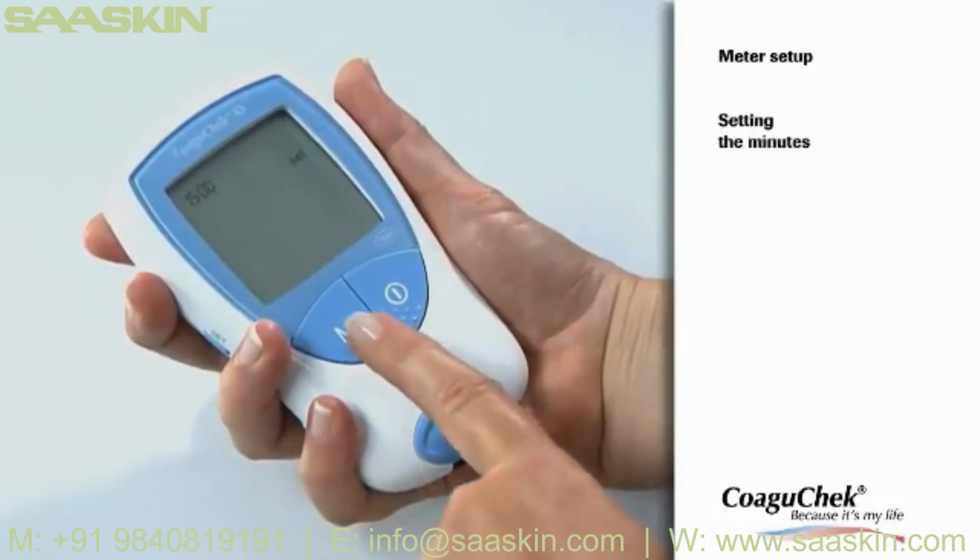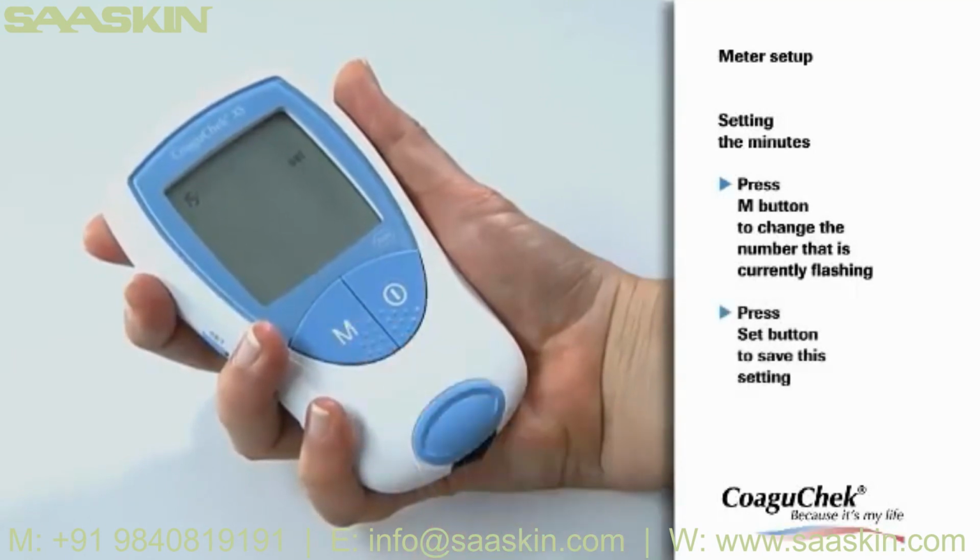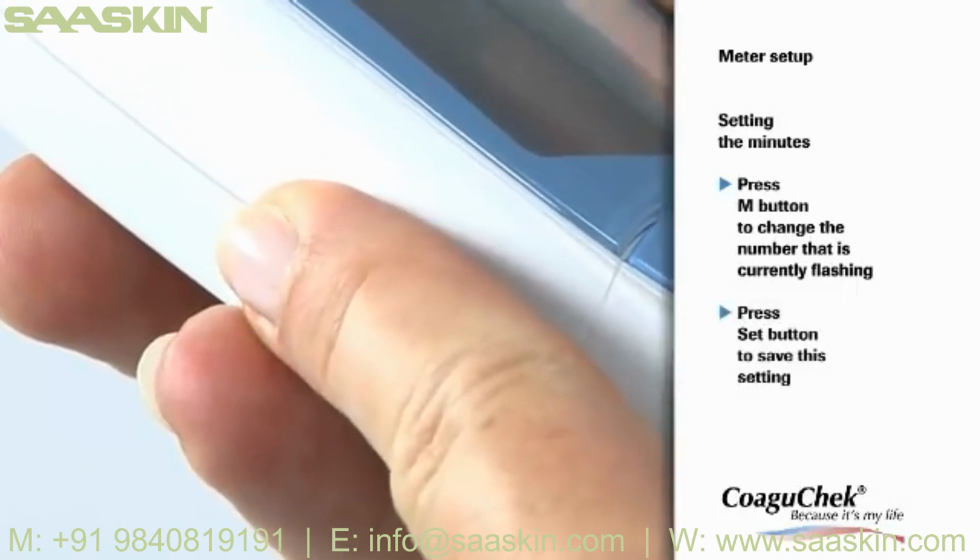Then repeat the last steps to adjust the correct minutes. And finally, press the Set button to save the new time settings.